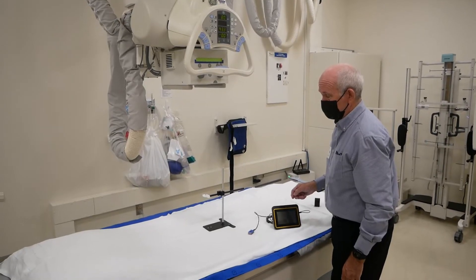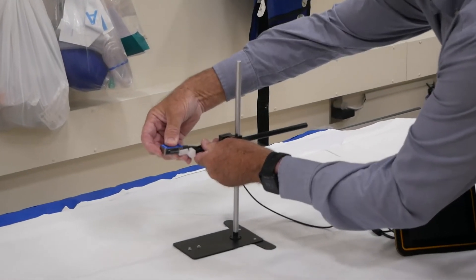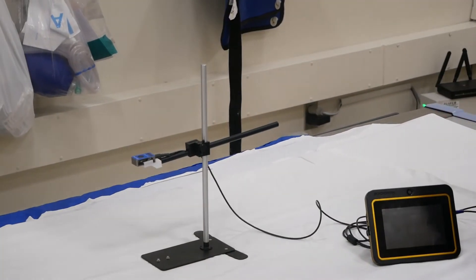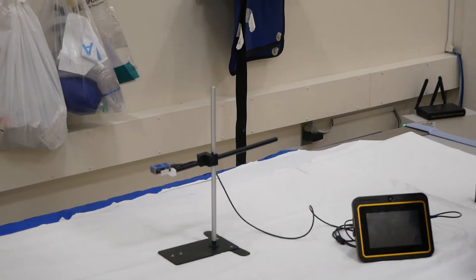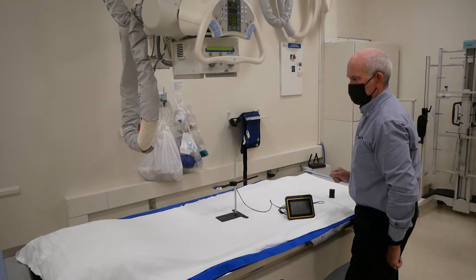With the sensor connected, it is recommended to use the AccuGold test stand when measuring. We will now attach the sensor to the sensor rod then place it directly in beam of the x-ray machine. For additional stability you can retract the wings from the base. You can now make an exposure to capture a measurement.